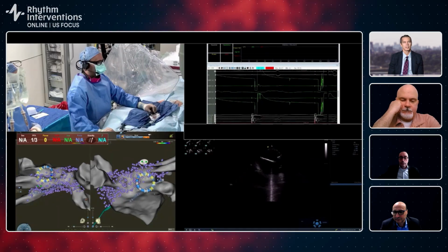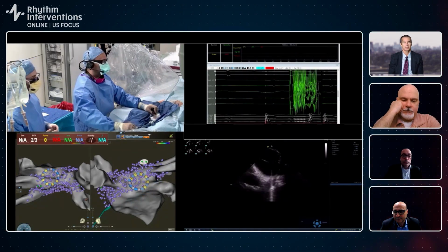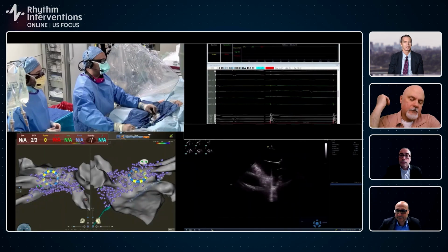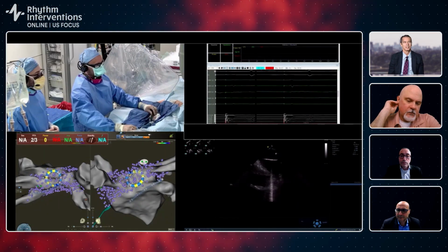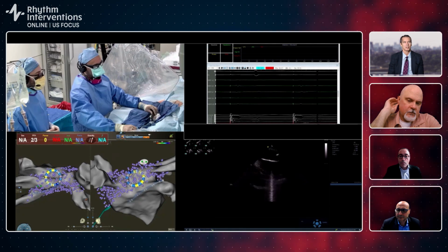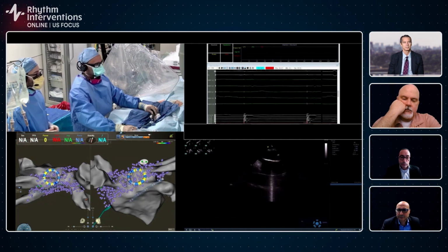Well, congratulations. I think we'll wrap this up in the interest of time. I think our panel will be staying with us, but Moussa, that was an excellent case. I think a lot of people are very excited to have a system that we've been working with for years with the CARTO system, now having an available PFA catheter. So thank you very much.